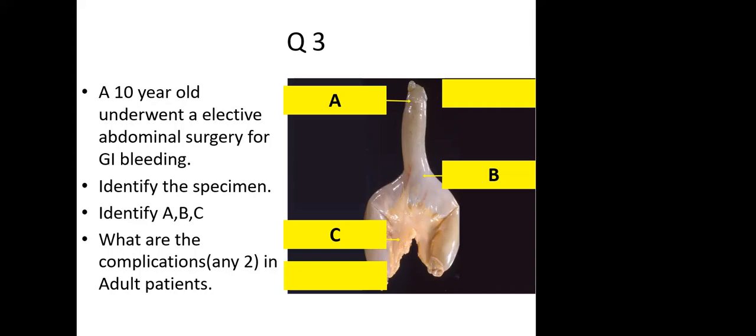Sir, age less than 40, narrow base, long Meckel's.